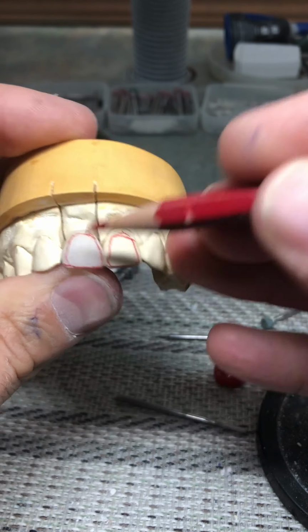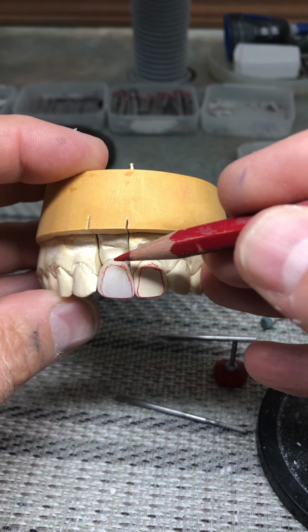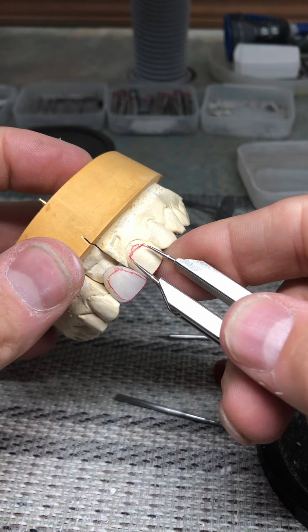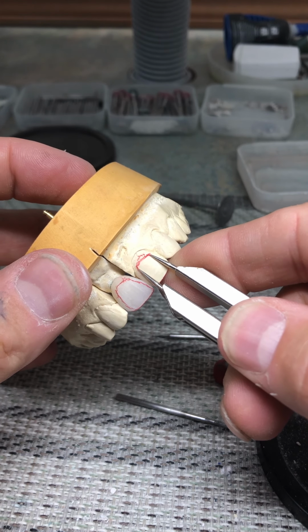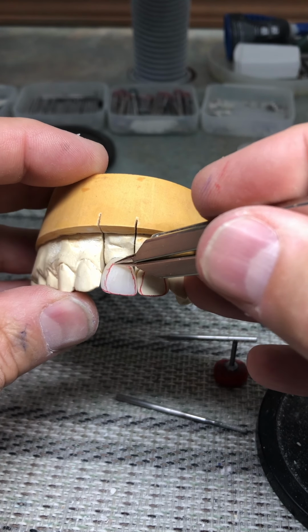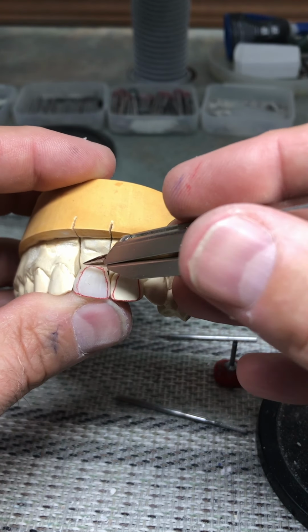these subtle lines to affect the contour. You can see this is improved. It's not quite broad enough. If I measure how broad the interface of these two line angles are compared to here, I need to move this interface slightly towards the distal to make the gingival third seem a little bit wider.